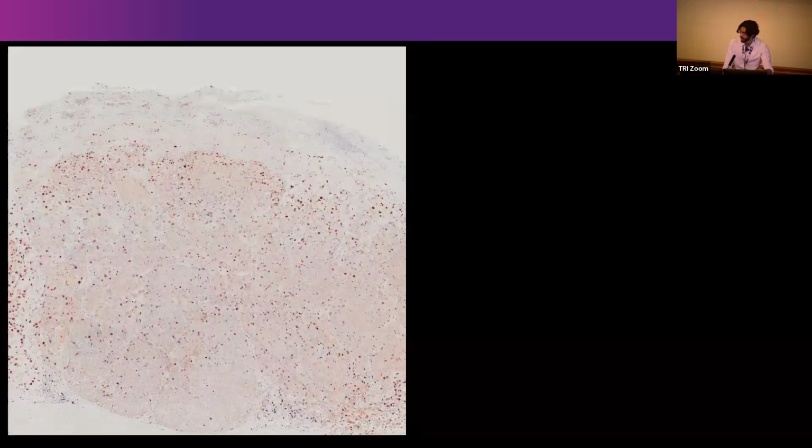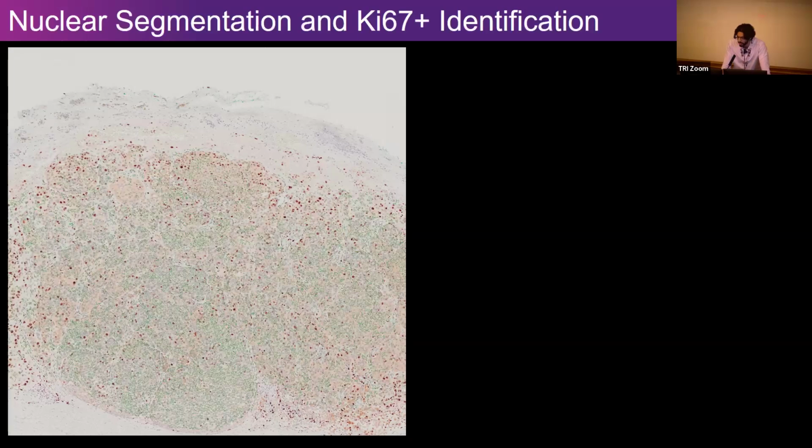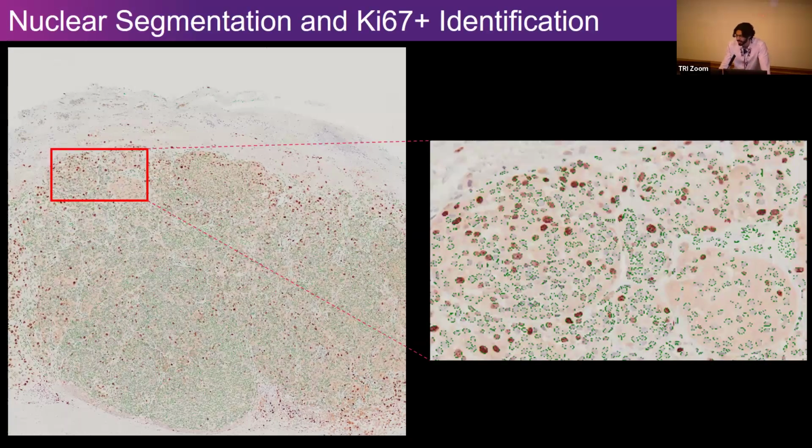So this is just an example of how the pipeline works. This is actually available to use for any IHC markers that you want to look at. I believe it's up to about 4 different markers you can look at in IHC that you can analyze at a single time. This is an example of a patient primary melanoma that's stained with Ki-67, with the brown cells being the positive cells and a counterstain of hematoxylin for all negative nuclei. So what StrataQuest does is it automatically segments these cells, and we can get a few different metadata from these, being different sizes, intensity of each marker, and a few other things that we can correlate.